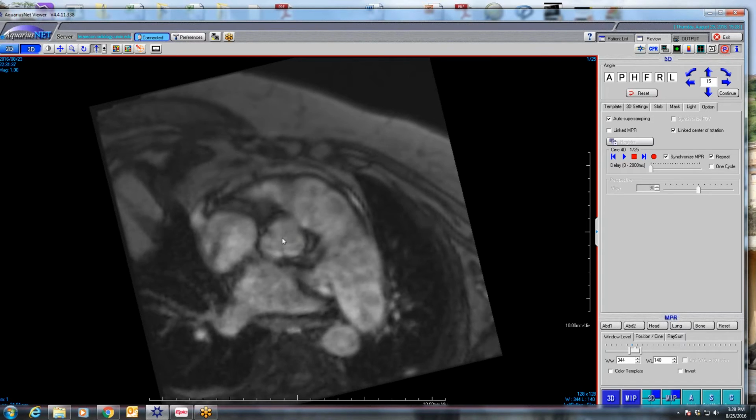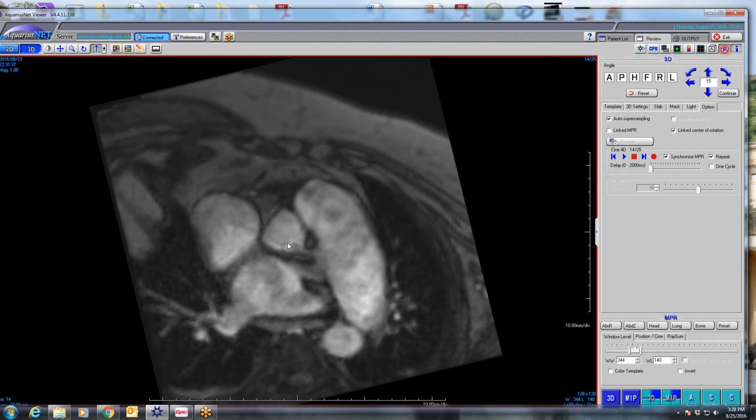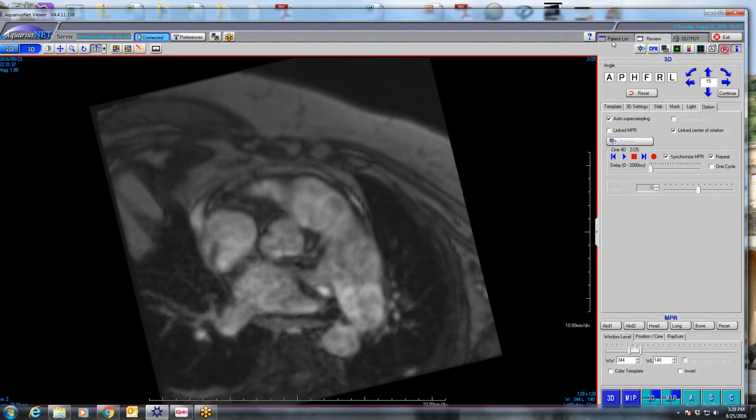and this is her aortic valve, which is more severely stenotic. So they were going to have to go in and replace her aortic valve, and they were wondering what to do with her pulmonary artery. And I think they're thinking about replacing it as well, given her main PA, although I don't know if that will help or not.